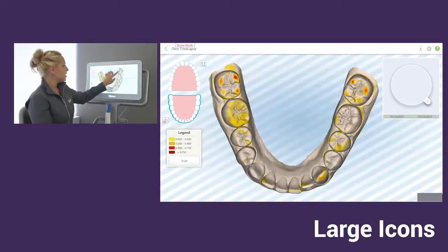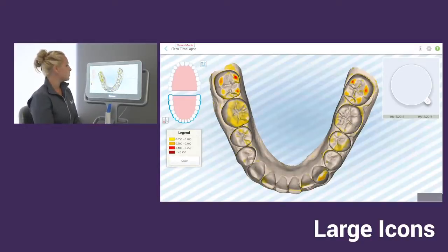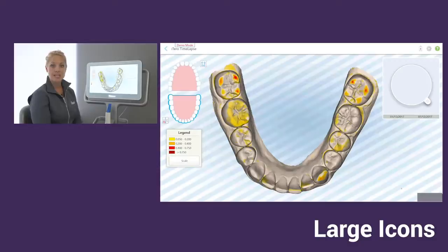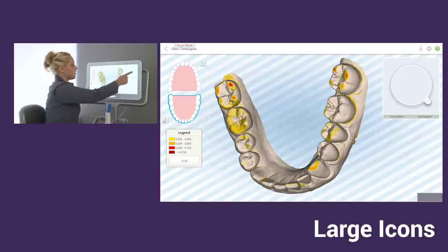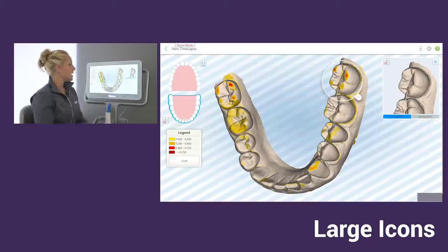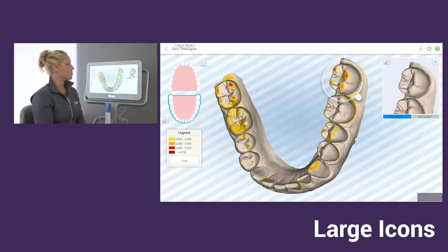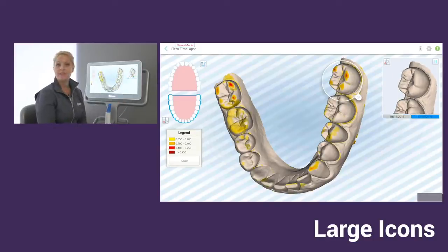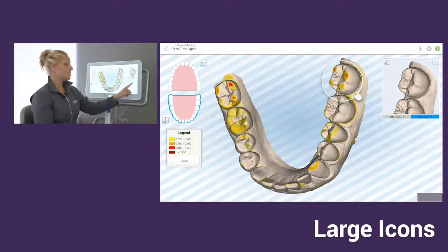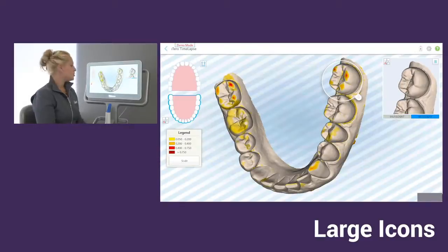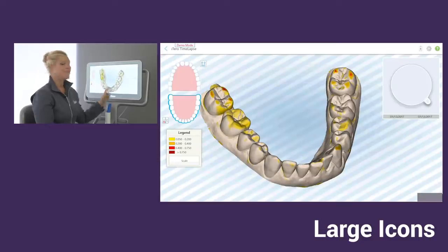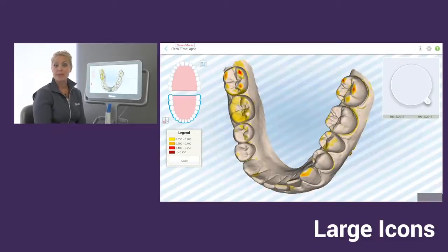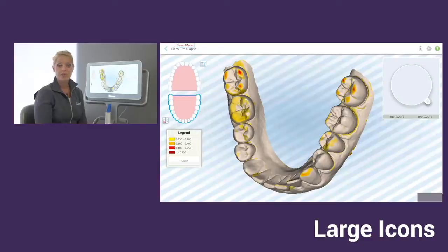When we're looking here at this patient, we do have some change right on the molar. If you wanted to compare the two scans with time lapse, take the magnifying glass and we can drag it right on top of that tooth. And now you can see the two images toggle back and forth. You will notice that it will highlight the dates, so it'll be easy for you to differentiate that and explain that with your patient. A lot of offices are using this feature to show their patients tooth wear or recession or tooth movement as well.